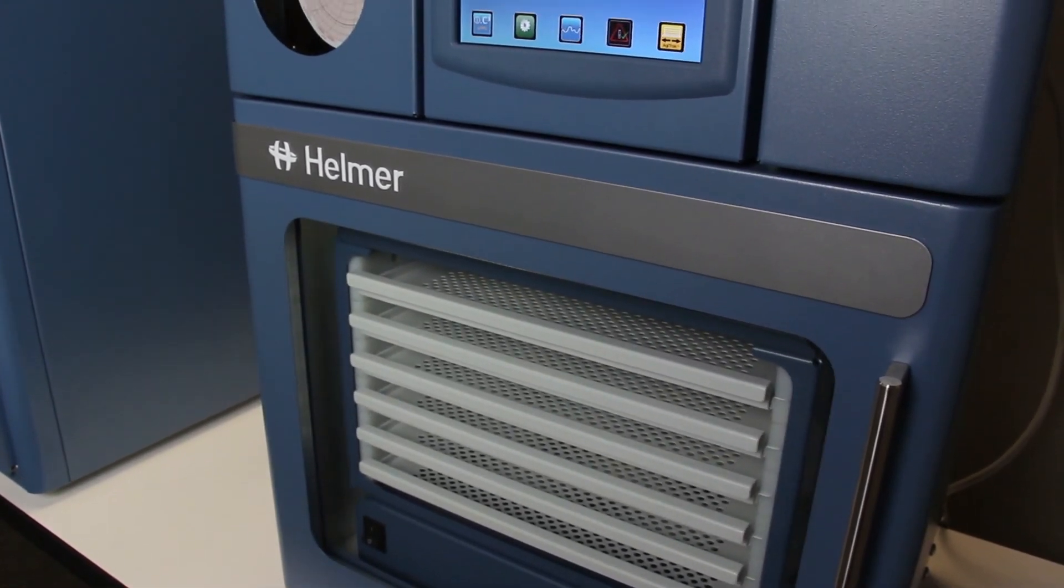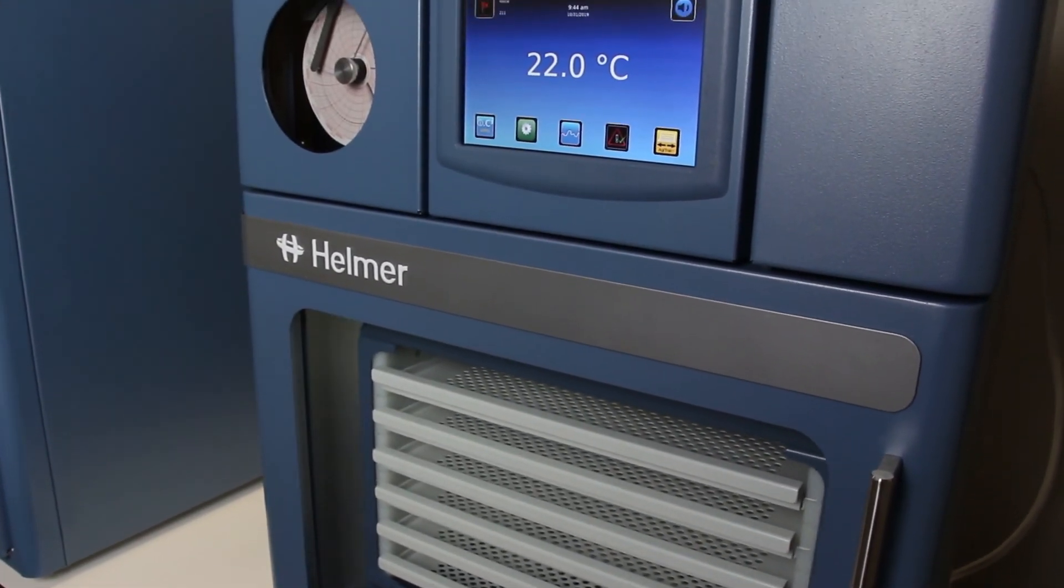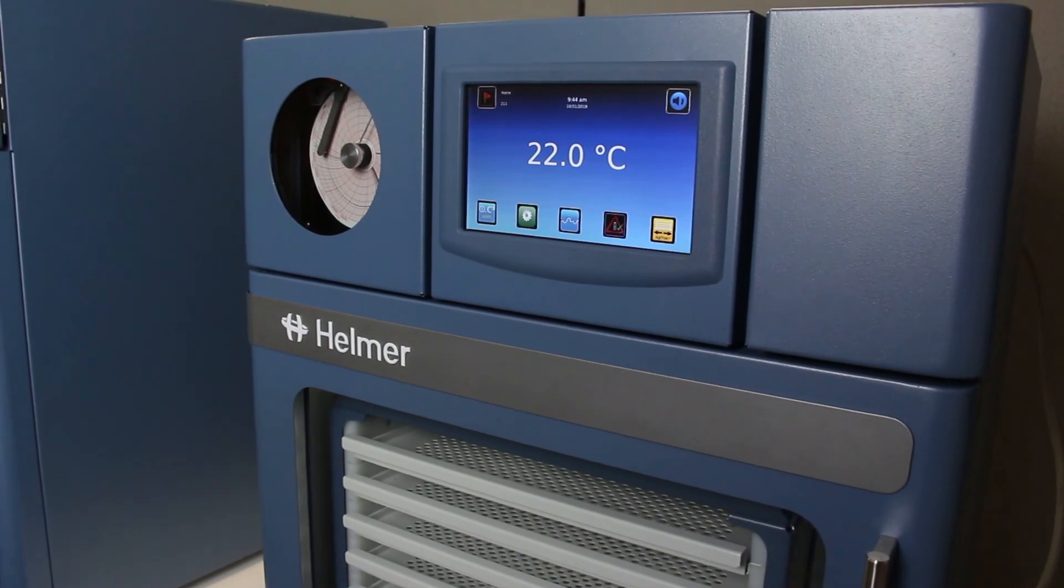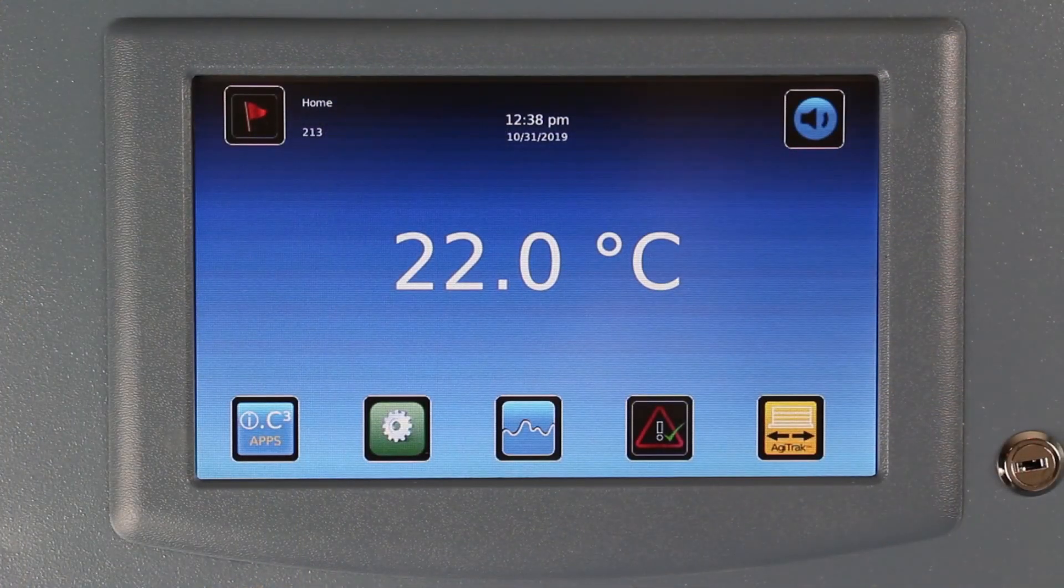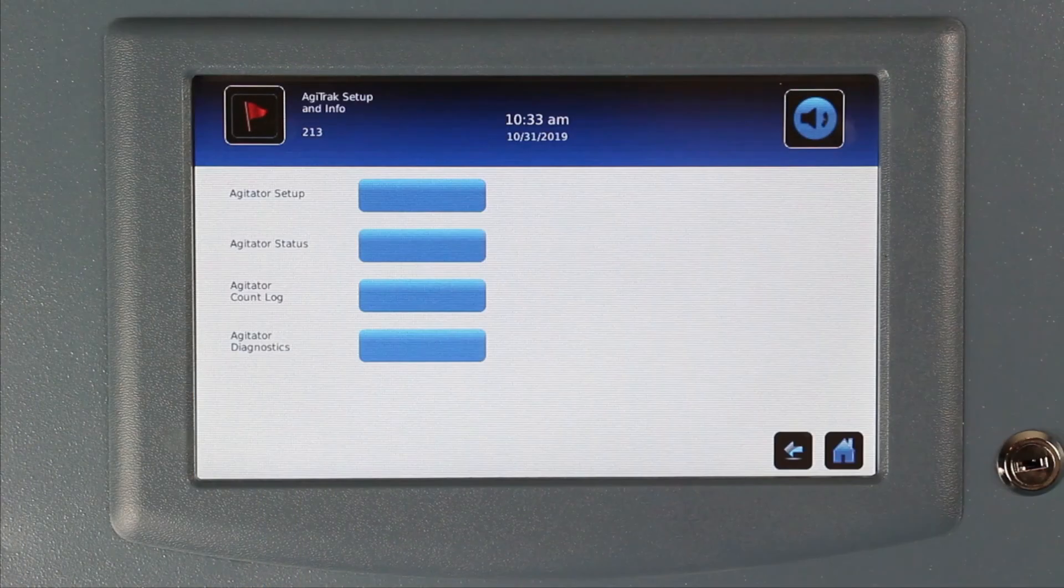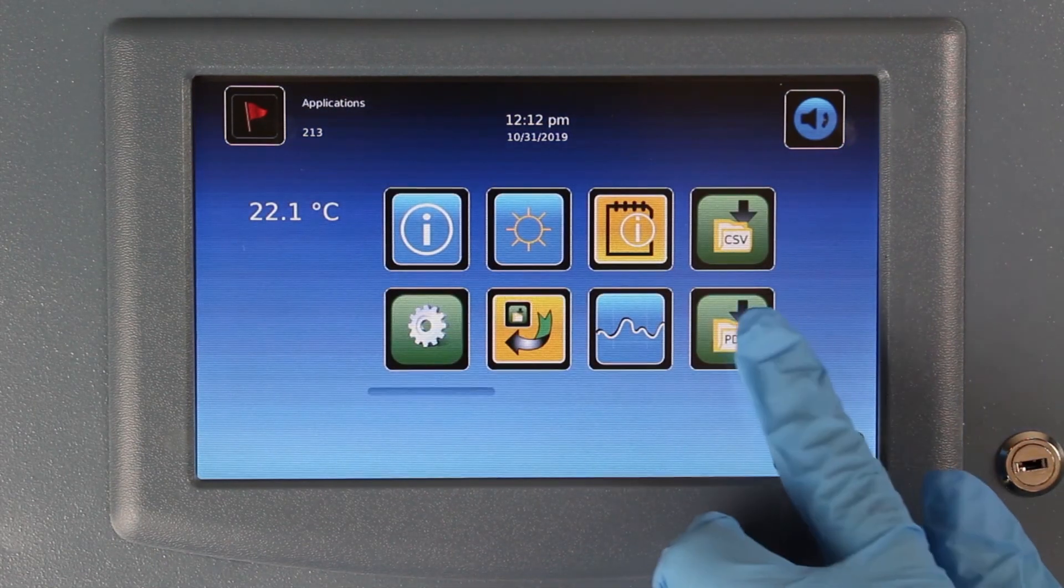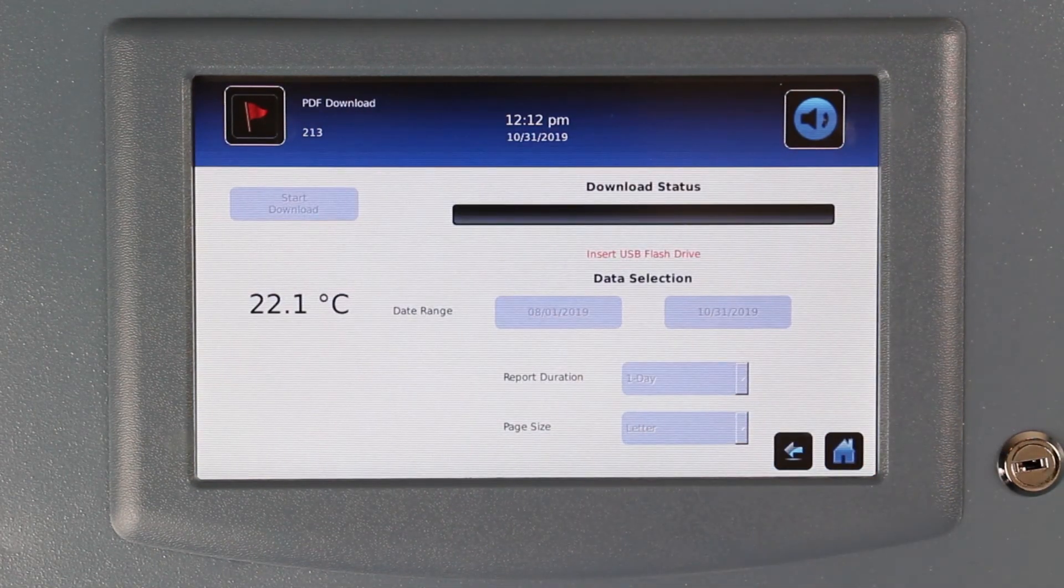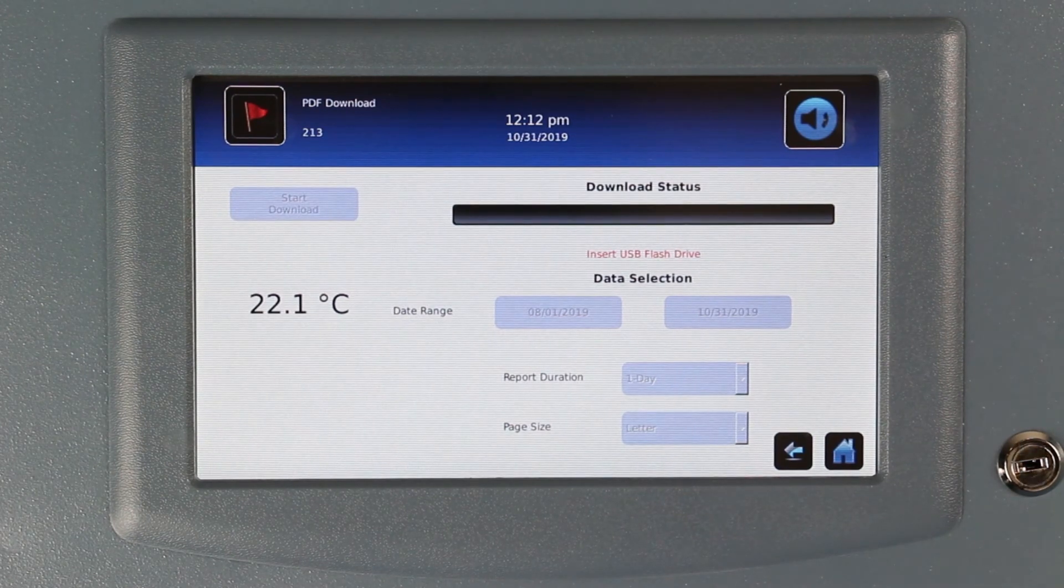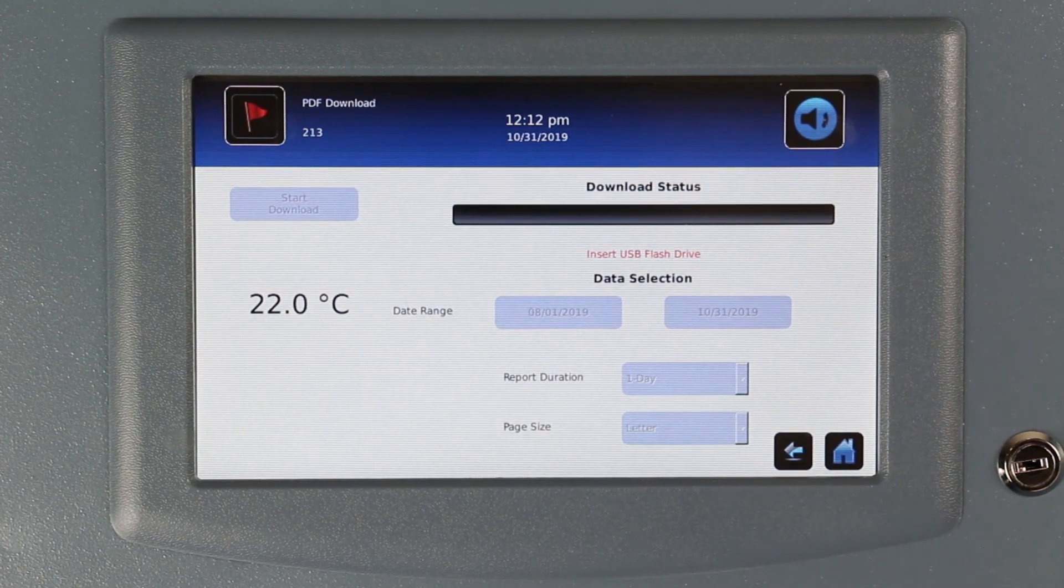In addition, ProLine platelet storage systems incorporate the IC3 information center, a touchscreen user interface with advanced features such as Agitrack agitation monitoring, the ability to download up to 10 years of temperature data, and the ability to generate PDF temperature graphs and event reports.